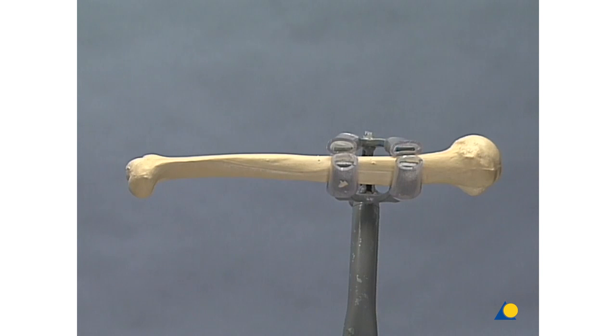Simulating the prone position, we fix the humerus model in the clamp with the ventral surface downward.